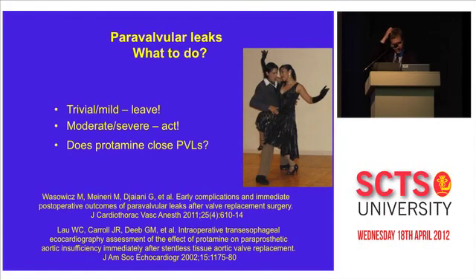So, very easy. If it's trivial or mild, we leave it, and we just accept it. If it's moderate to severe, we have to do something. The question is always that famous confirmation from the surgeon: don't worry, once you've given the protamine, the paravalvular leak will disappear. Now, does it happen like that?